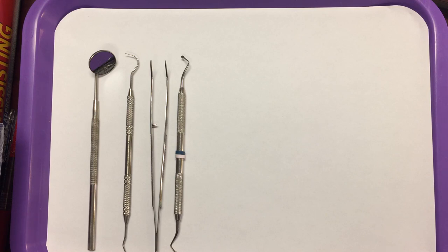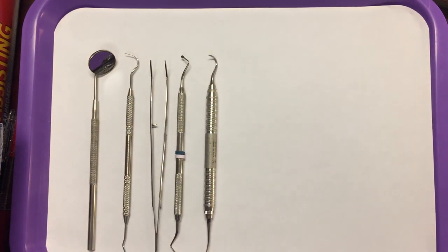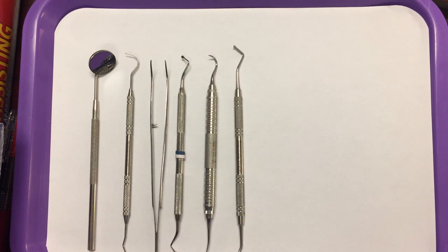Then we need to add the scaler. The scaler is used to remove deposits from the teeth or to remove cement after the crown has been cemented in place. We then have a cord placing instrument, or gingival retraction cord placing instrument, and that places the cord into the sulcus.